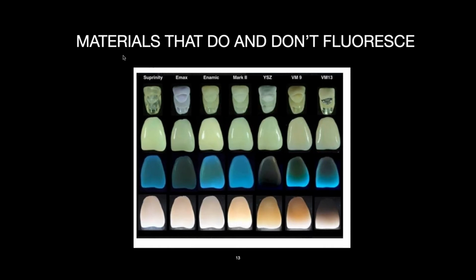And so they have lots of different little lights now that you can get and test the strength of the fluorescent effect of the teeth. And you can use several materials that VITA has to put underneath the ceramic, such as the Fluo Intense powders from the Lumax, or the, I think it's called, I'll show you in a second, on the VM9 and 7.